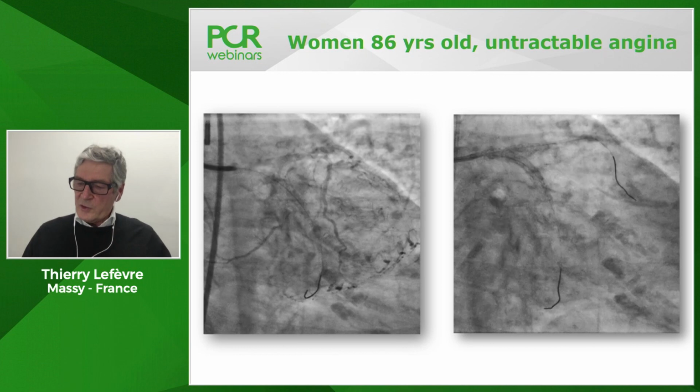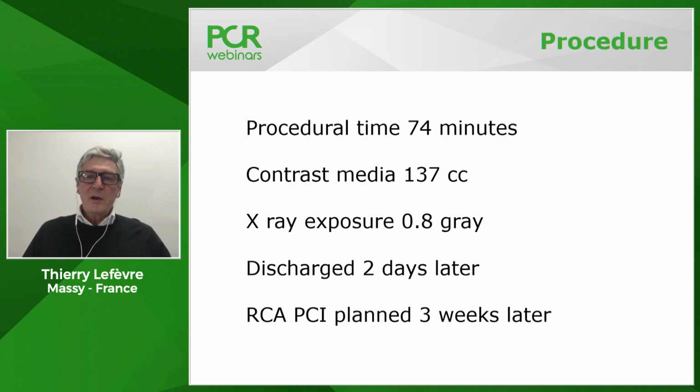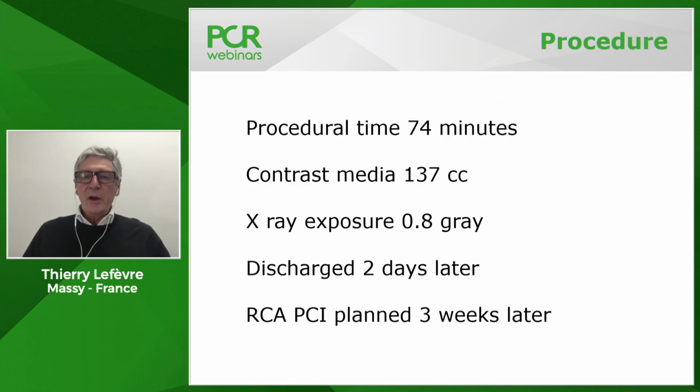So the procedure was a little bit challenging, of course, a little bit more than a 1 hour procedure. 137 cc of contrast media. The patient was discharged 2 days after the procedure. And of course, we planned to do the right 3 weeks later.